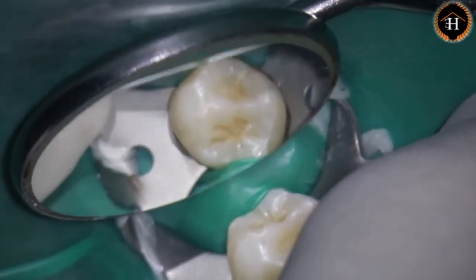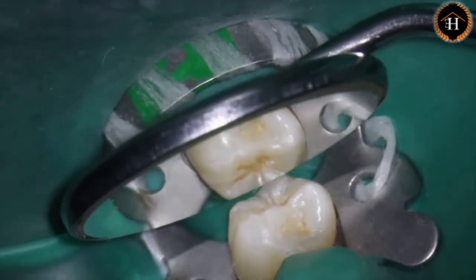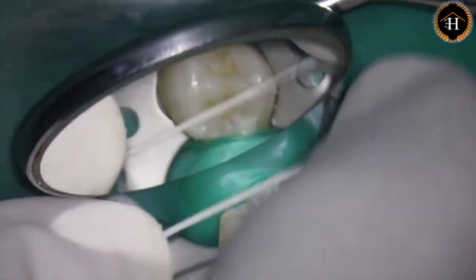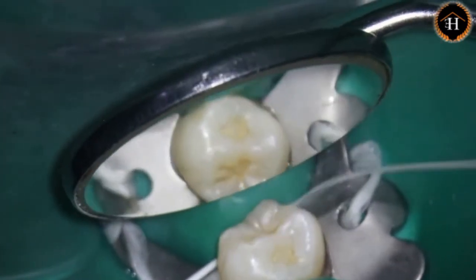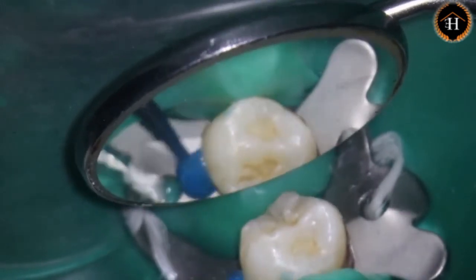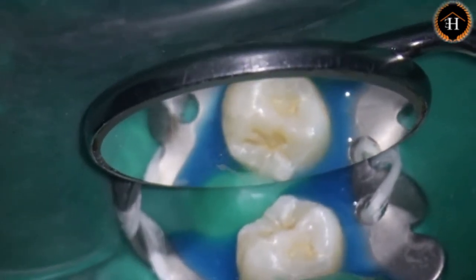Now I push the rubber dam down from the clamp on both sides. Then with the help of floss, I push the rubber dam properly into the interdental area so that it helps in better sealing — the same way for the distal side also. Once that is done and it has adapted well, for even better sealing one can place a gingival barrier to prevent leakage of saliva. This is how single tooth isolation has been achieved.